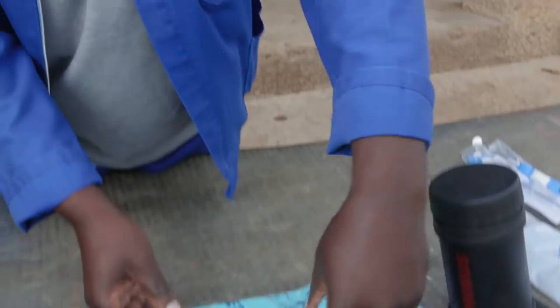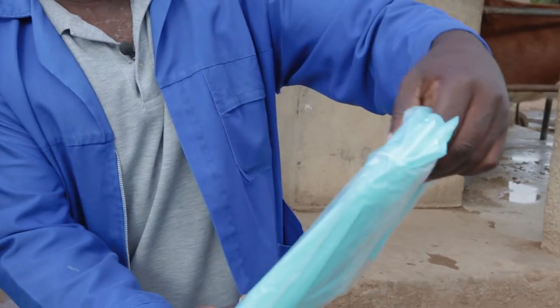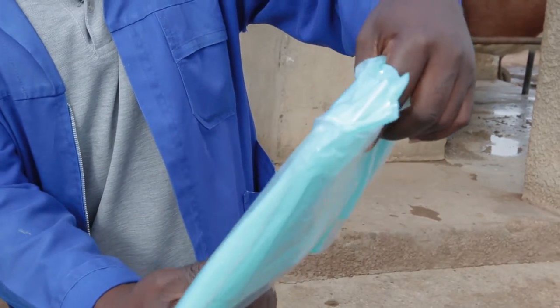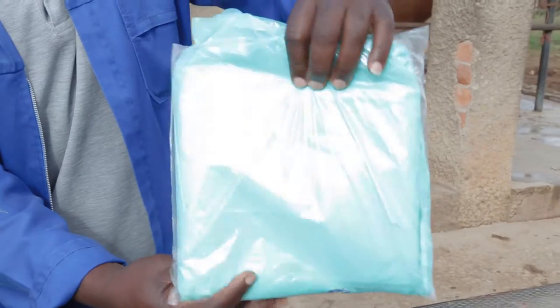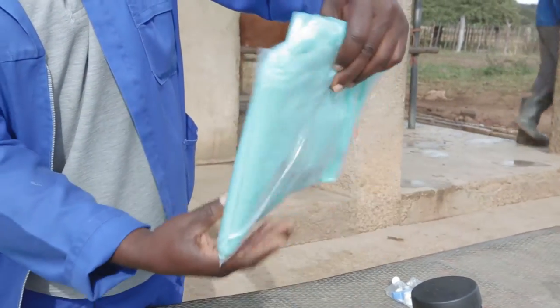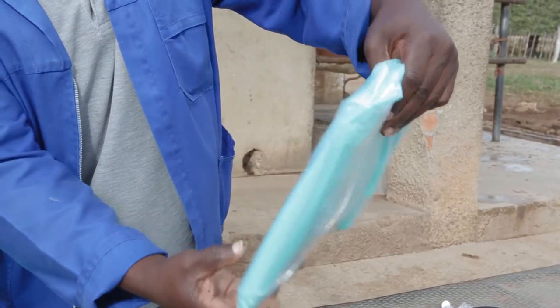This is a packet of plastic gloves. We call them AI gloves. These we use to cover the hand that goes into the rectum during artificial insemination.